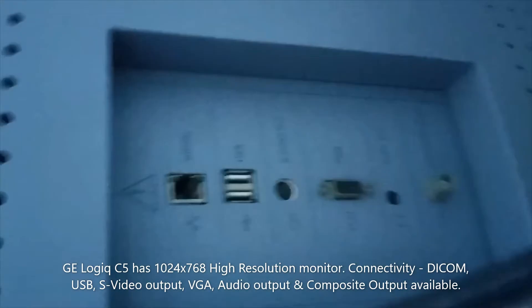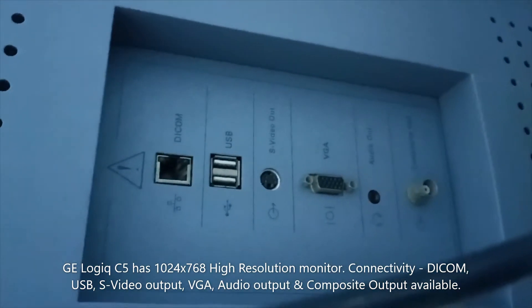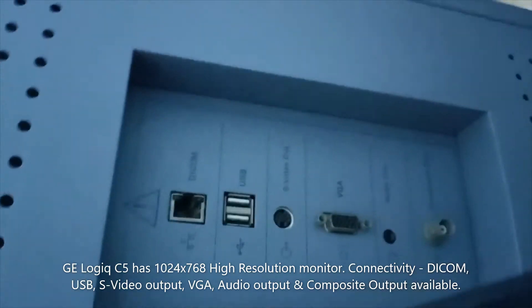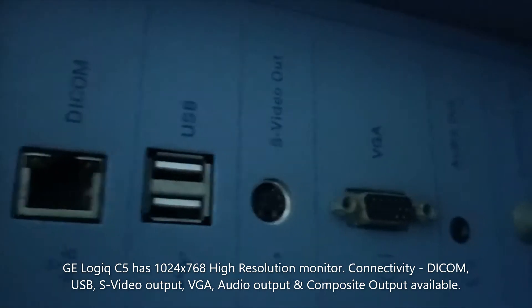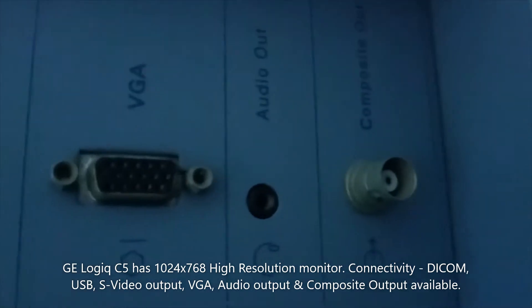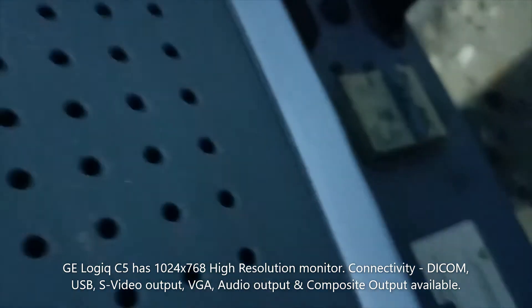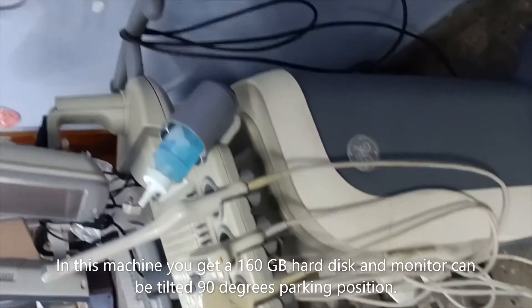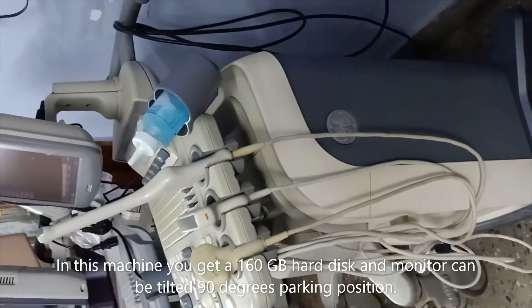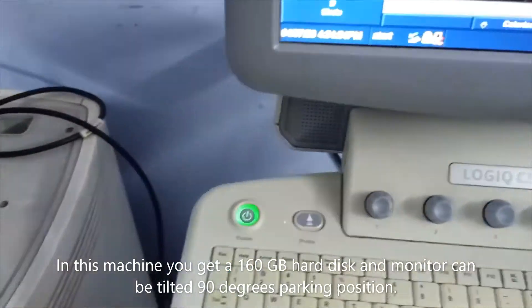This monitor provides a resolution of 1024 x 768 on a high-resolution 15-inch LCD display. For output connectors you get DICOM, USB, S-Video output, VGA output, audio output, and composite output. There is also a VGA-type connector so you can connect another monitor to the machine. This machine has a 160 GB hard disk, and the monitor can tilt to a parking position of up to 90 degrees.